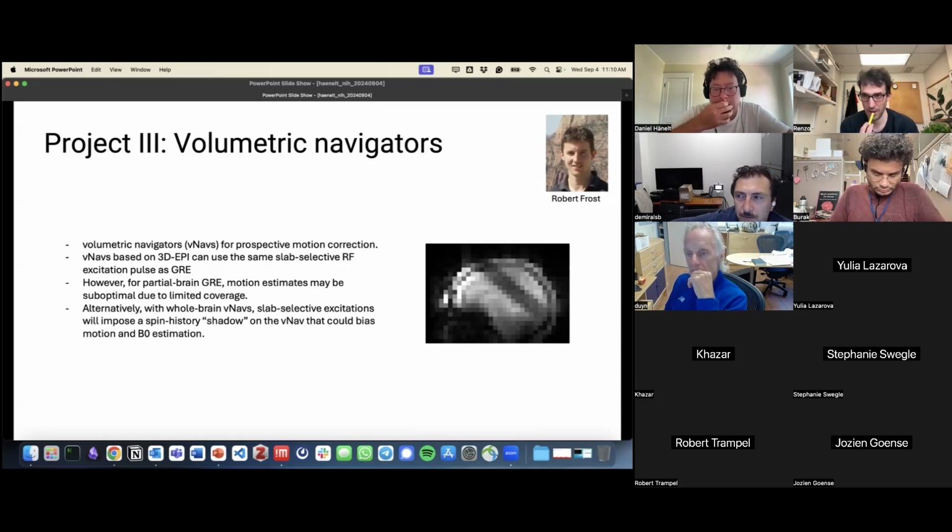Our Siemens machine will have an upgrade to the XA30 system in 2 months or so, and I'm not sure we have the time of flight sections already purchased, but I'm trying to combine this vascular imaging with motion correction for different types of people's respiration patterns. But maybe I am too far ahead of what we may need to do. I just want to hear what you may suggest.